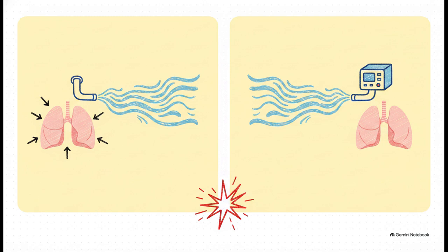The ultimate goal here, especially for conscious or semi-conscious patients, is avoiding patient-ventilator asynchrony. You absolutely never want the machine aggressively pushing air in right as the patient is desperately trying to breathe out.